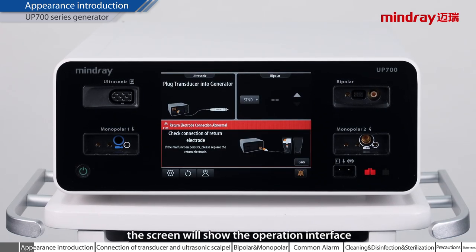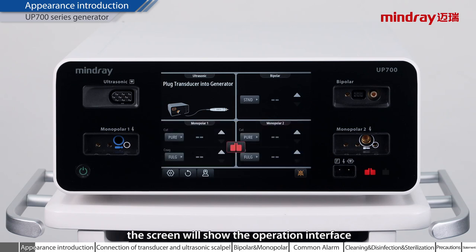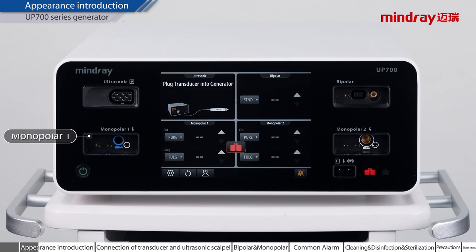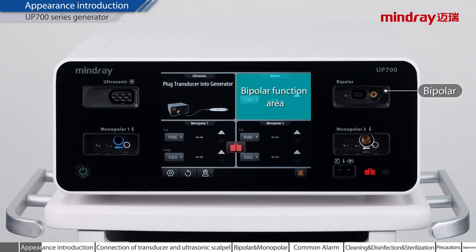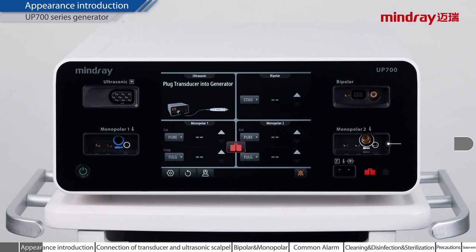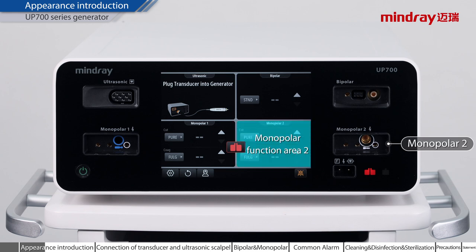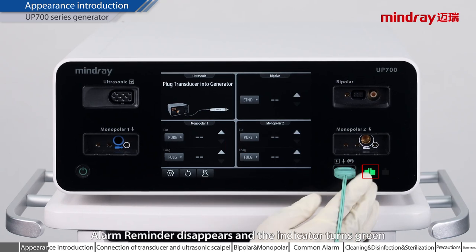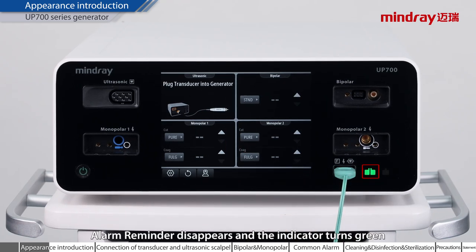After startup, the screen will show the operation interface. Transducer interface. Ultrasonic scalpel function area. Monopolar 1. Monopolar function area 1. Bipolar. Bipolar function area. Monopolar 2. Monopolar function area 2. After the neutral electrode plate is connected correctly, the alarm reminder disappears and the indicator turns green.